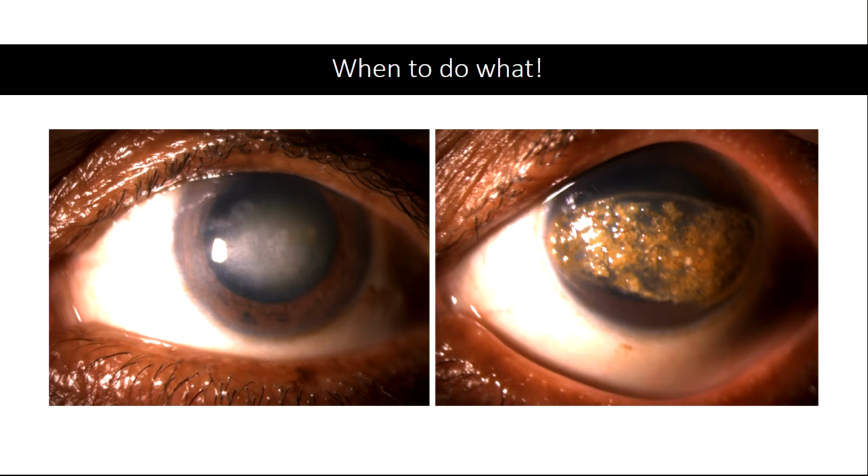The picture here, probably we could get away with just a cataract surgery. Looks like a long-standing old scar. The patient is used to vision with this scar and probably should not be subjected to a full thickness or even a lamellar keratoplasty. This one, on the other hand, has undergone PTK several times, twice or thrice. We still were foolhardy enough to actually try a superficial keratectomy and only phacoemulsification. We did get away with the phacoemulsification, but the visual outcome was subpar, and probably a DALK in this situation would be better for the patient.